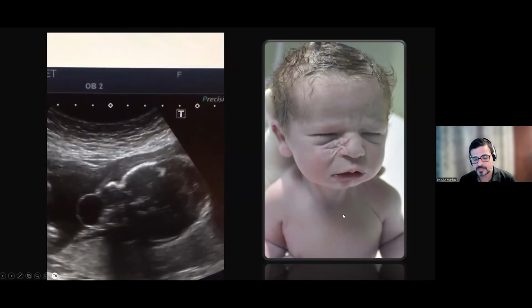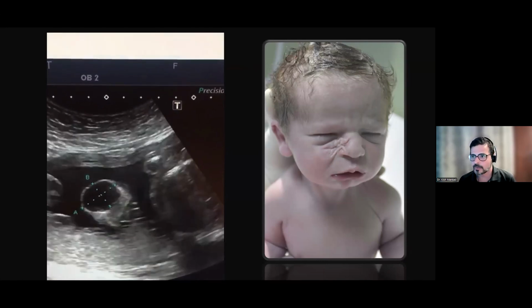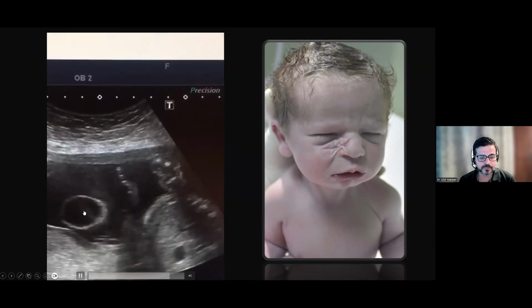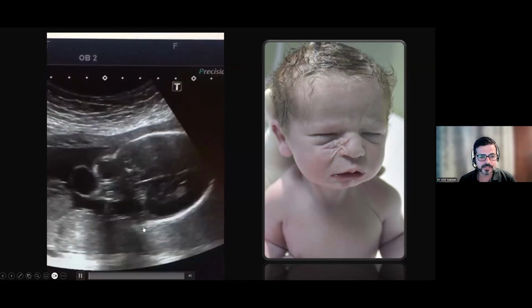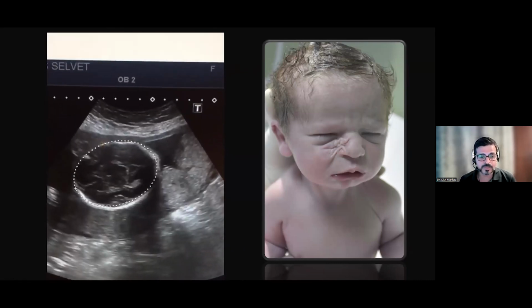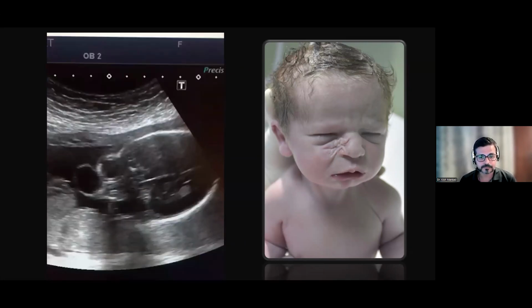The child doesn't look very happy. They generally don't at that age anyway. But overall, good outcomes in terms of a very non-invasive approach to this dacrocystocele. And ultrasound is so beautiful in showing the dynamicity of where it's originating from. And these are some of those entities which could be missed as well on ultrasound. So there could be medico-legal implications. So make sure that you correlate your MR with ultrasound on a regular basis.